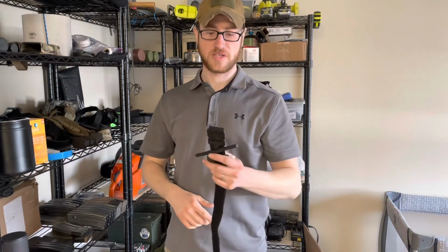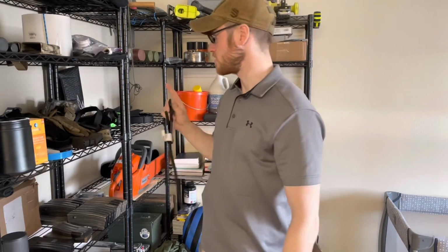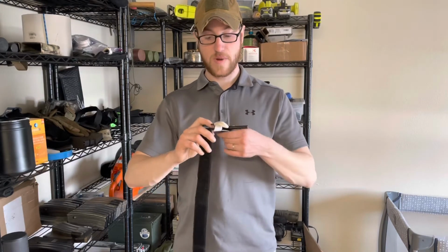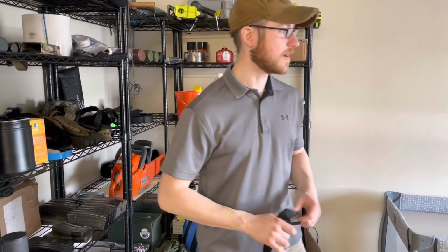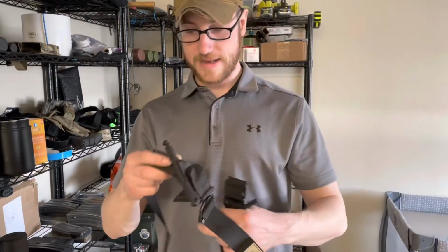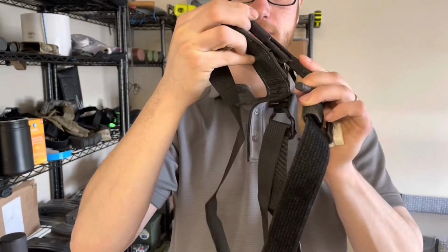You absolutely can do a tourniquet on the bone and get occlusion. It works incredibly. I'll roll in a video right here of a SOFT-T Wide being used to do that, and then also the windlass being secured hilariously, because of the way that the SOFT-T Wide works. Let me see if I can grab a SOFT-T Wide. So the SOFT-T Wide has a triangle right here that secures your windlass.